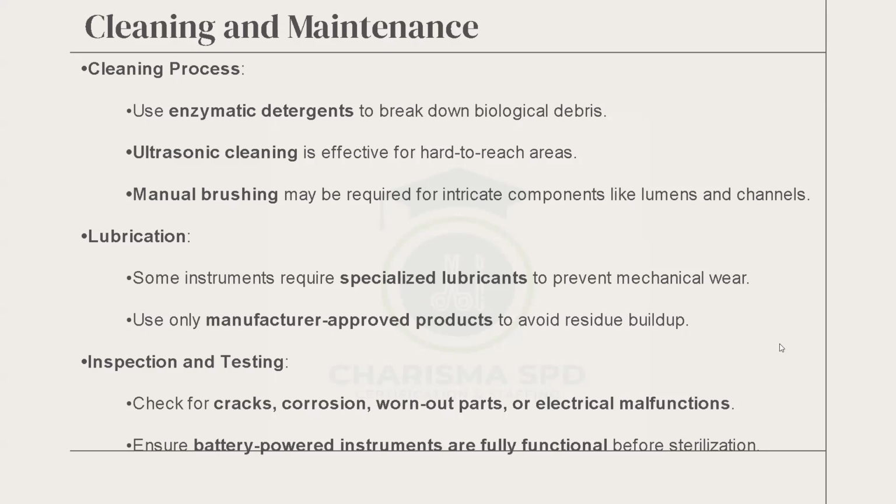Lubricating, yes. Some parts of the powered surgical instrument need to be lubricated. You will get training as to how to do it, or in some cases the vendor rep or the manufacturer rep is on site and does some of these jobs.